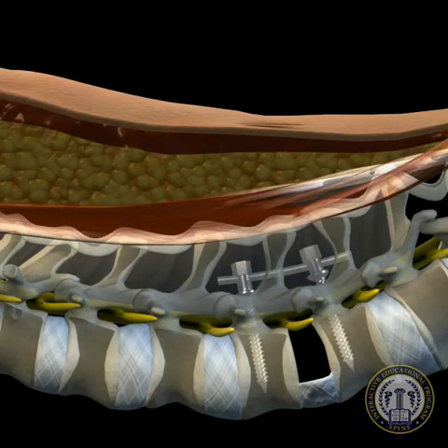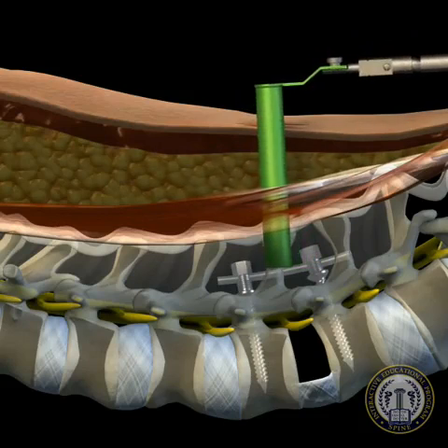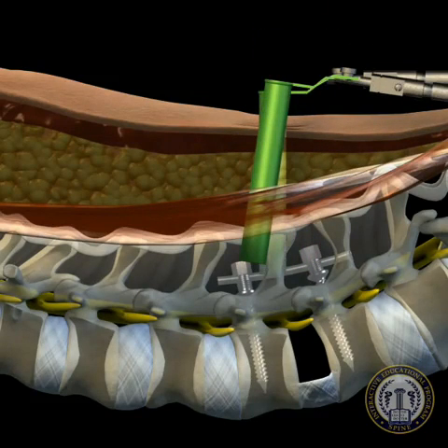If there is concern about contralateral neural element compression, then a direct decompression can be obtained by repositioning, wanding, the ipsilateral tubular retractor, or by placing a second tubular retractor through the contralateral incision.